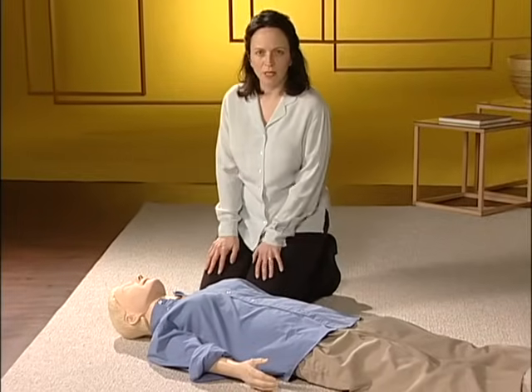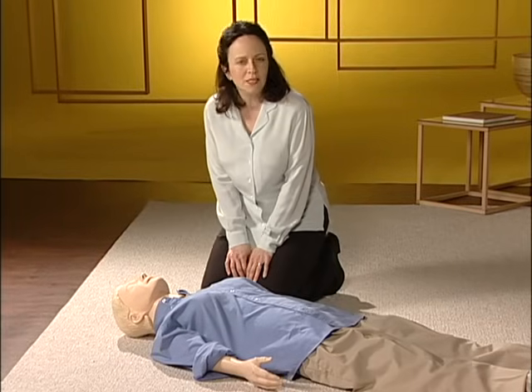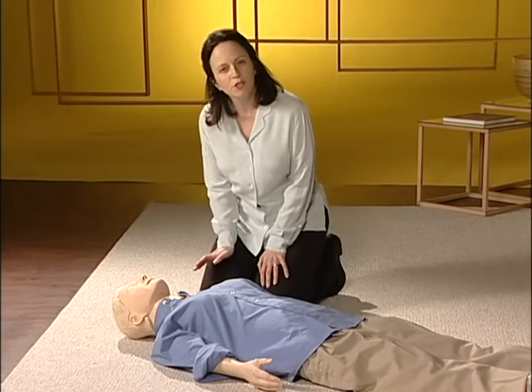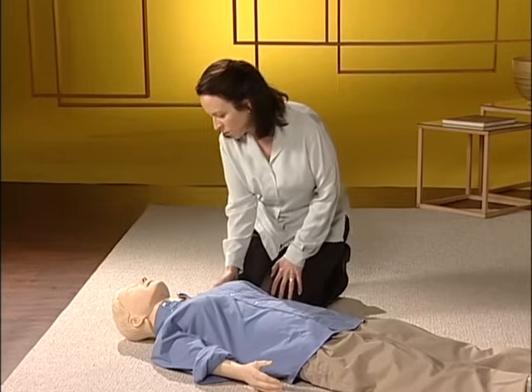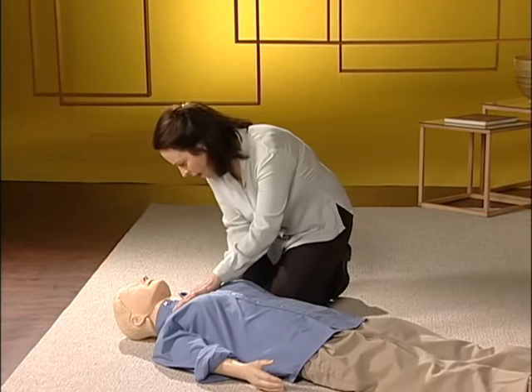Someone in cardiac arrest is unconscious and not breathing normally. They might not be breathing at all, or they might be gasping, or making what seems like snoring. The first thing you should do is try to wake them by tapping or shaking their shoulder and calling out, "Are you okay? Are you okay?"